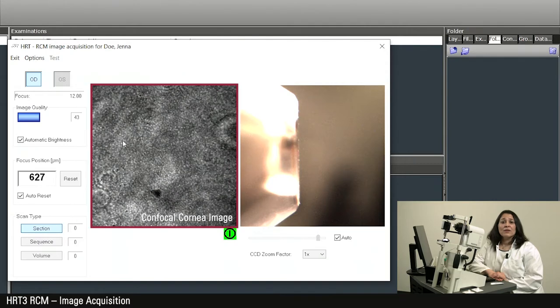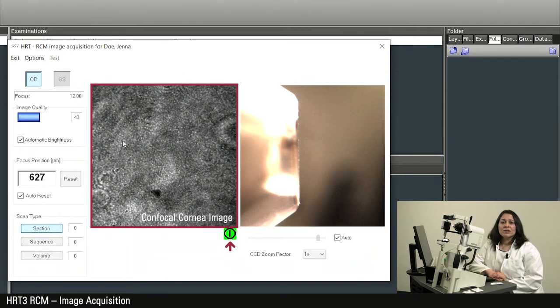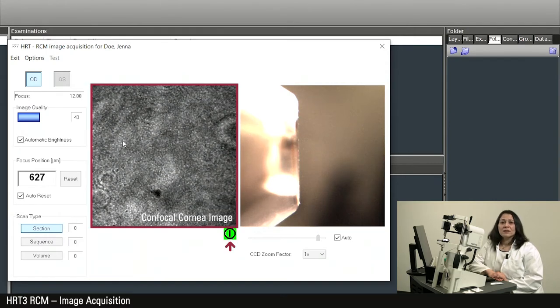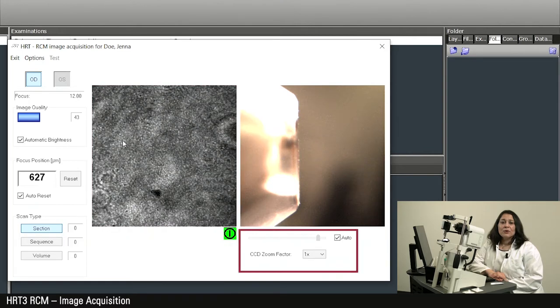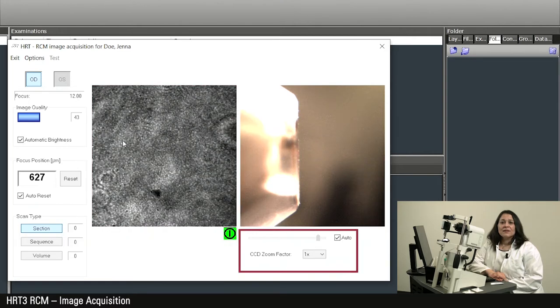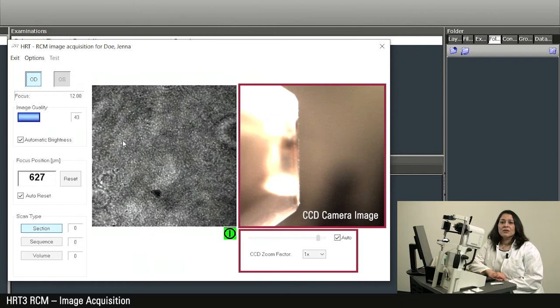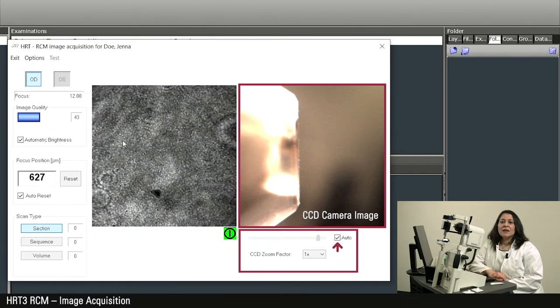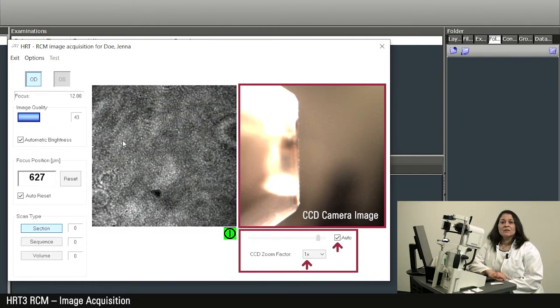Under the confocal cornea image, the start or pause button is located. To the right you will find the settings for the CCD camera. Here it is recommended to leave the automatic settings activated and zoom factor 1.